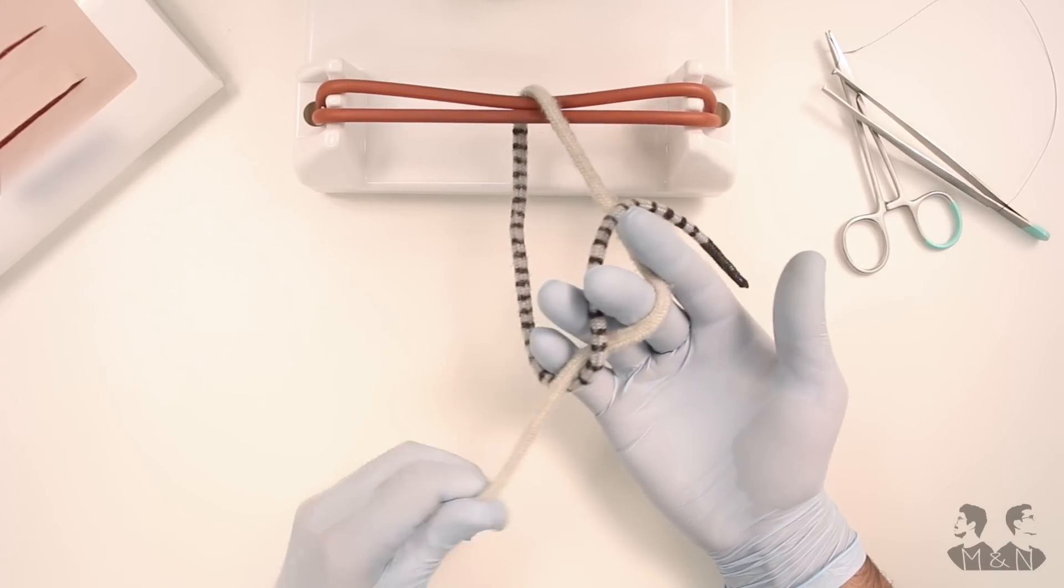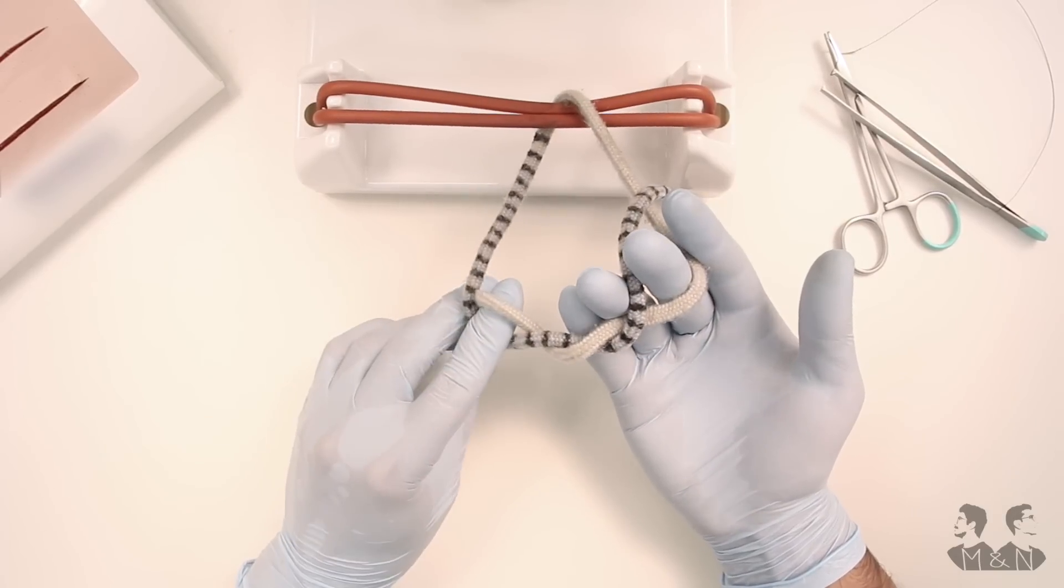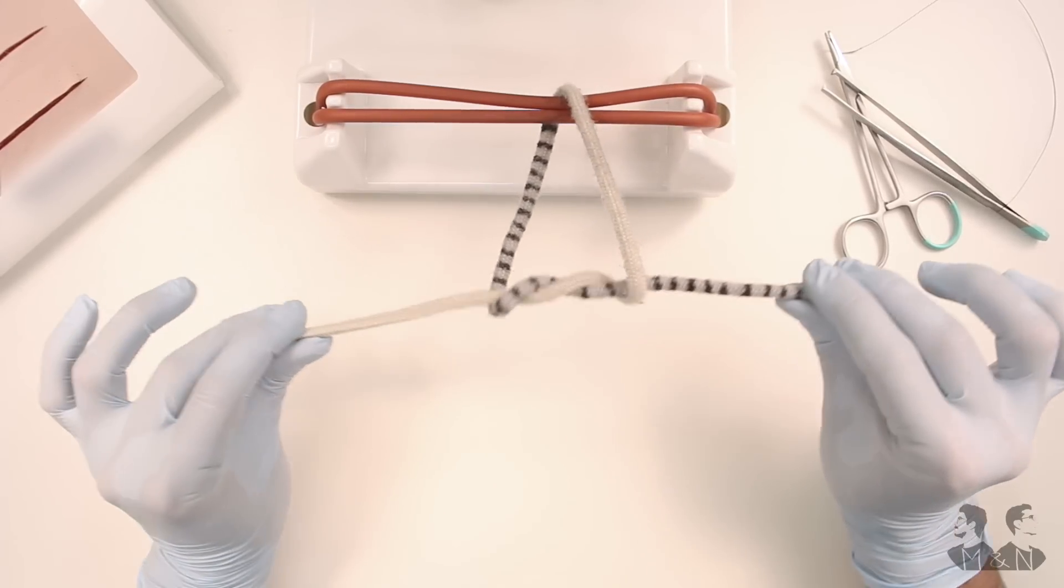Instead, the index finger of your left hand grabs for the basis of the striped end. Now, you wrap this one around the white end, which is still located in your left hand.